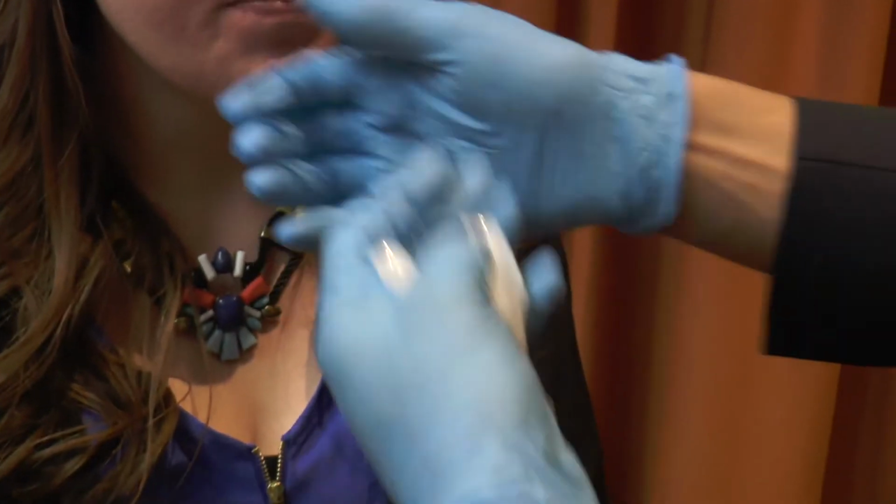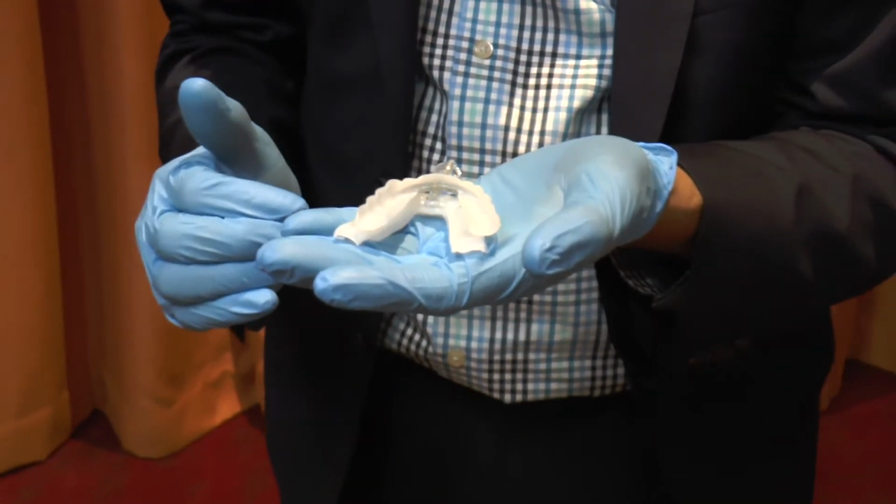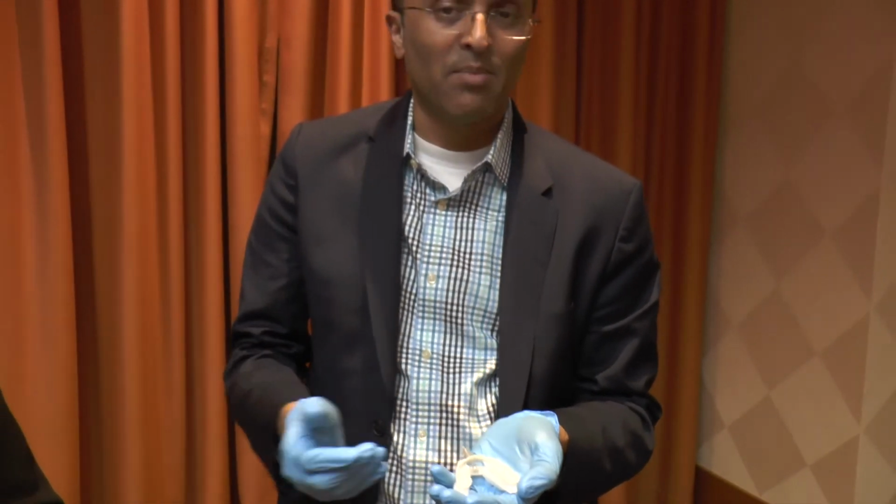What you may find at times, if the patient actually tries to pull on both sides, because of the curvature of the teeth, it's very difficult for them to disengage from this device. And as a result, you may get patients that panic.